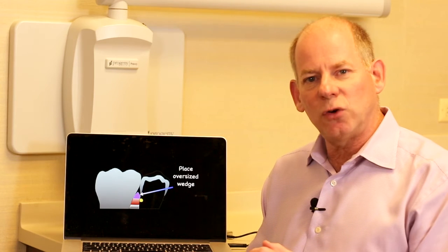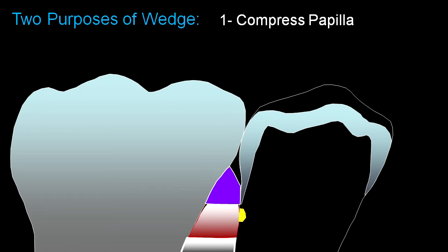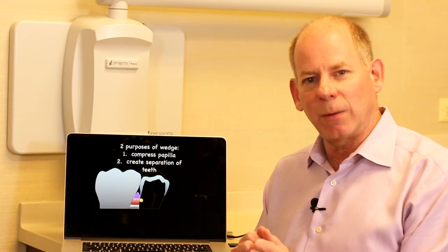The first thing I want you to do is use an oversized wedge. You really want to wedge between these teeth to accomplish two things. First, the wedge compresses the papilla, or if you're using a rubber dam, pushes it out of the way — we need access to where that caries area is. The second purpose of this oversized wedge is to start creating restorative space and room for my matrix band.